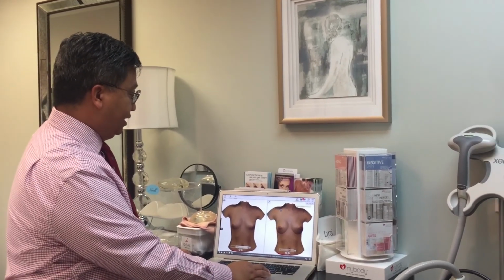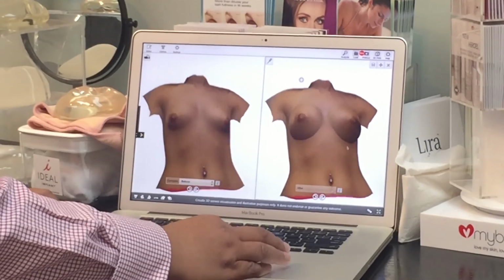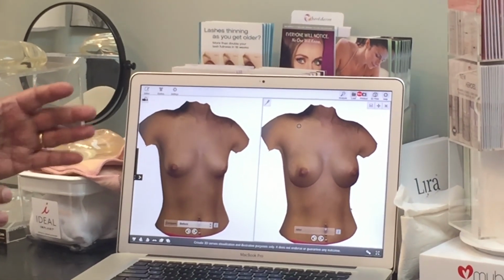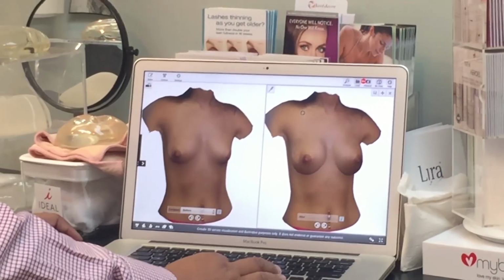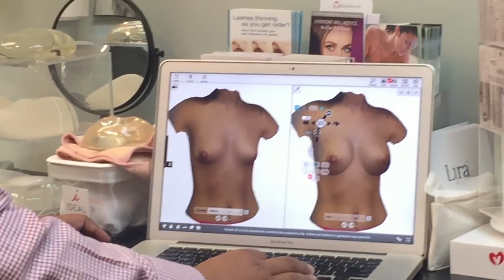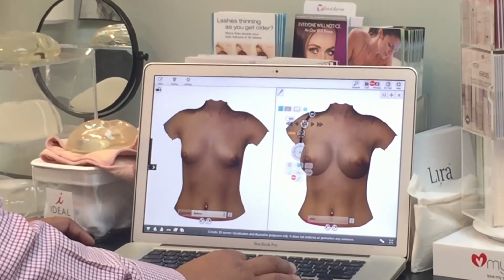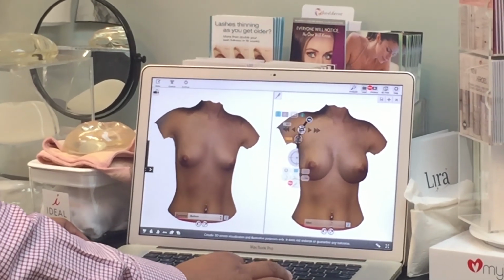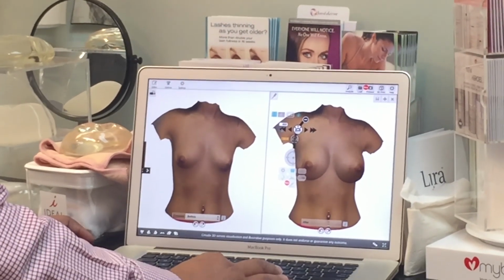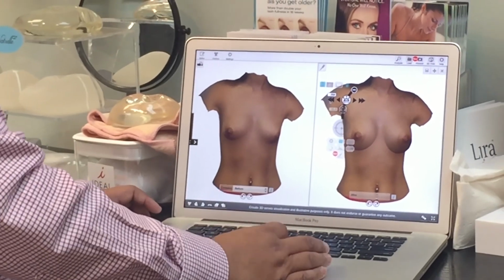So in this patient, this was a 350cc implant, and she looked at it and she said, that's exactly what I want. And that's exactly the kind of response I like to hear. But it's okay if they said, no, I really don't like that much. I wish it was bigger. We can just take this software and make it bigger. And then I ask them to take a look at it and say, what do you think about that? And we can basically really get very exact, down to the exact implant that we're going to use on the day of surgery. And that's a great thing to have this kind of tool to give patients really the certainty and the comfort of what they're going to look afterwards.